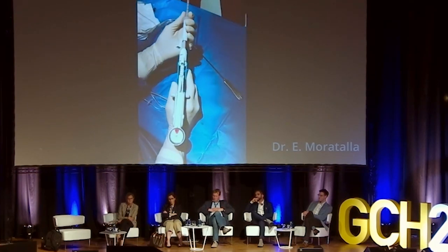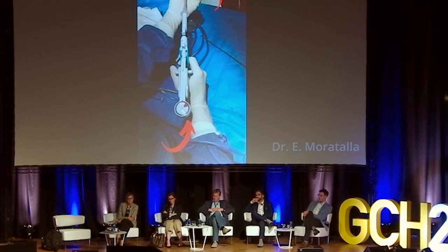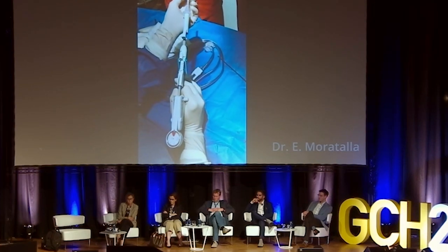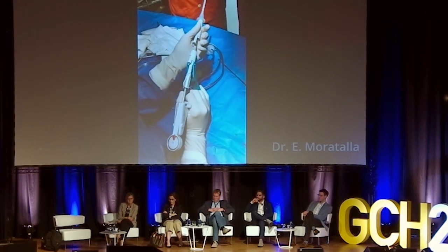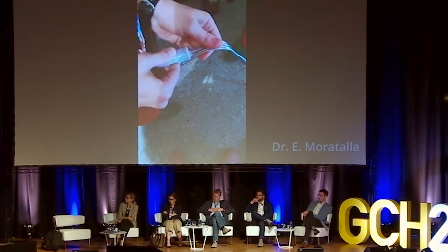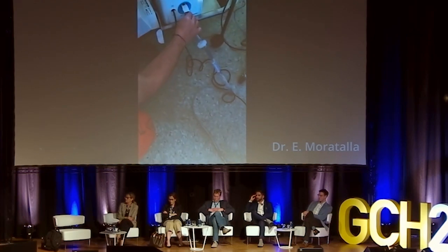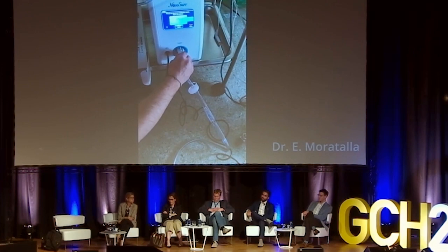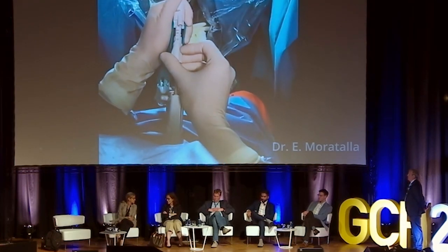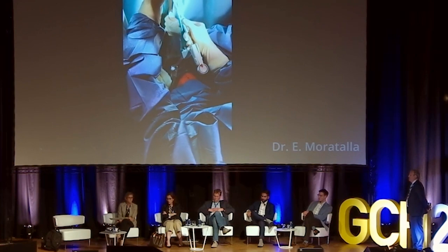We check the disposable device, how it unfolds properly, and how the wheel that indicates the width moves when we squeeze it. Make sure the array is completely enclosed by the external sheath. After dilating the cervix with a 6 mm rod, in some cases a 7 mm rod may be needed, we proceed to connect the filter and the device. We introduce the measurement of the length of the uterus in the device, in this case 5 centimeters. Advance to the fundus in line with the axis of the uterus, holding the blue front handle.